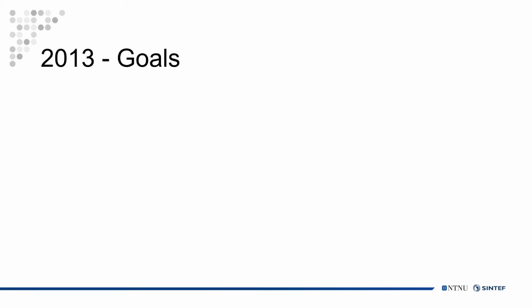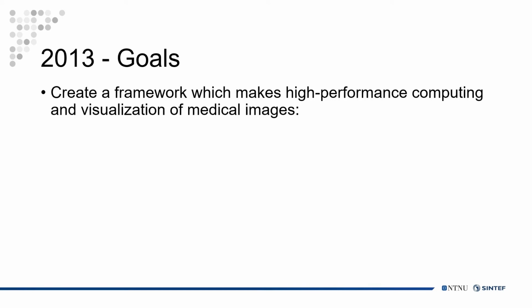In 2013, we decided to create a framework which made high-performance computing and visualization of medical images easier by using less code, handling image memory transfers for the developer, and providing several common GPU-based processing and visualization algorithms.